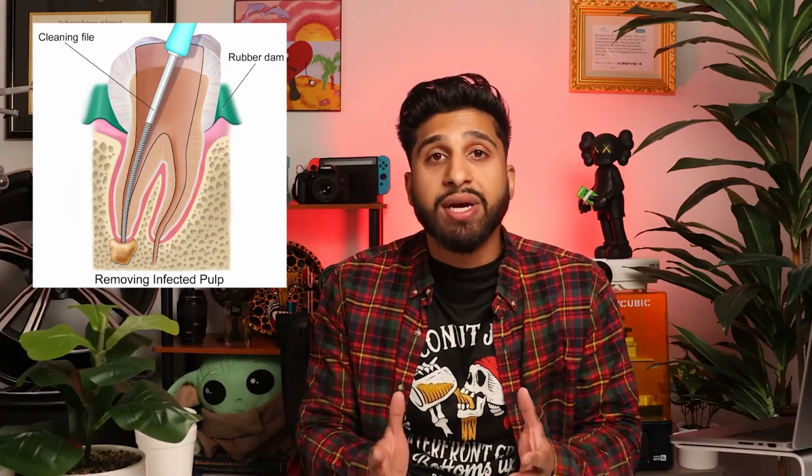All right, first and foremost, red flag immediately when examining this type of extraction case. This tooth has undergone root canal treatment. After doing a couple of these, you know these extractions aren't always the easiest and most predictable. Typically, a root canal treated tooth becomes hollowed out and brittle, making it more prone to fracture during extraction.